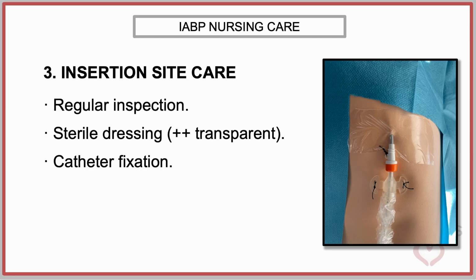Dressing changes should be performed according to institutional infection prevention protocols. For example, one possible routine is to replace gauze dressings every 2 days, whereas transparent dressings should be changed at least every 7 days unless earlier replacement is required due to loosening, soiling, or loss of dressing integrity.